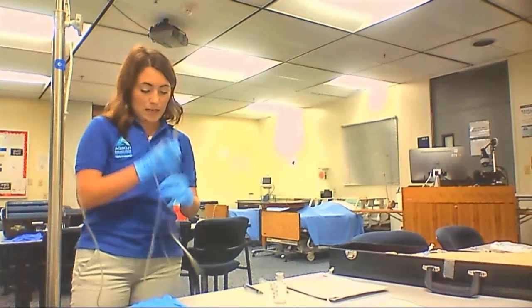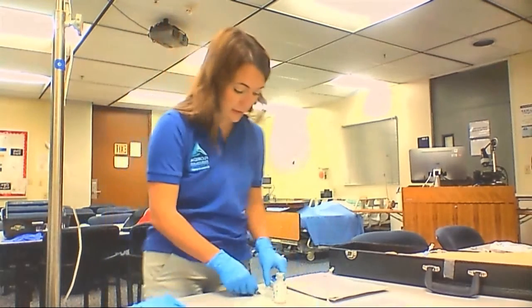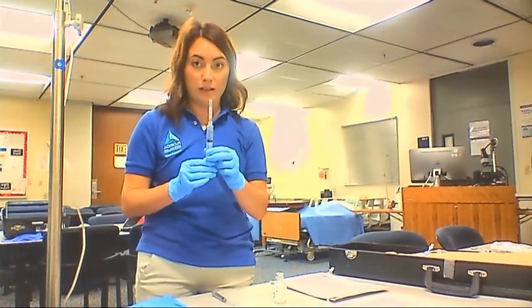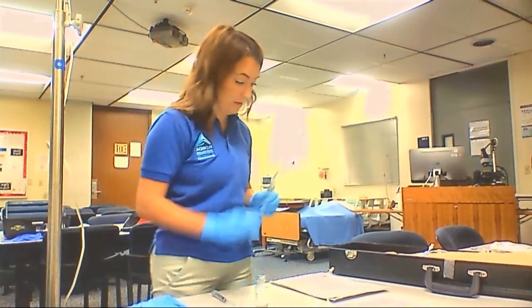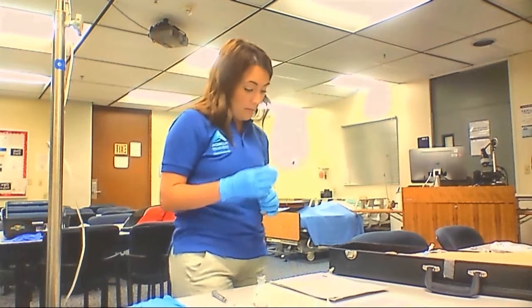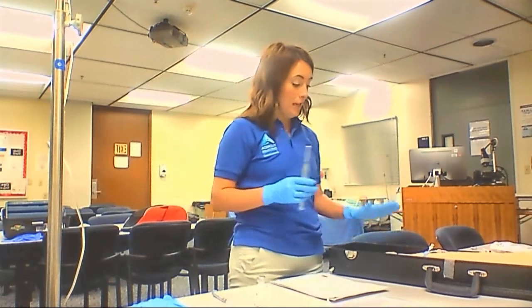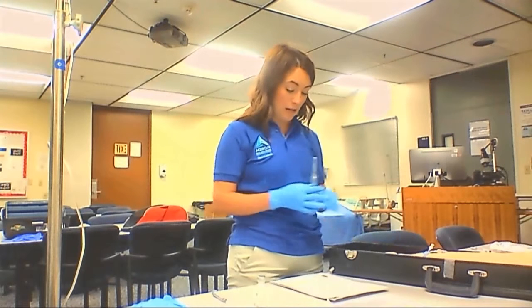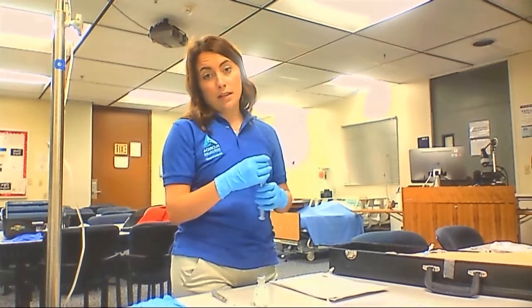And then I am going to set this down for the time being while I prepare my 6 milliliters of solution to flush through the patient's IV before inserting the needleless device onto the patient. I again want to make sure that I am working with the correct patient, and I am. And then I want to make sure that I educate the patient on why the medication is being given to them.